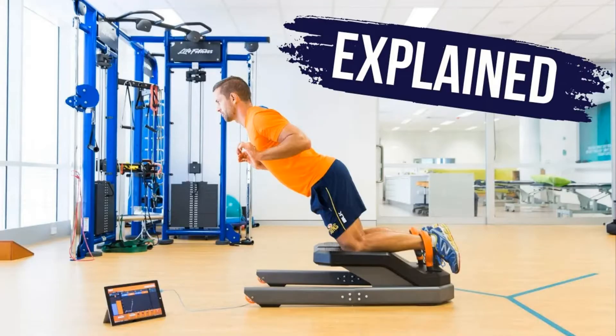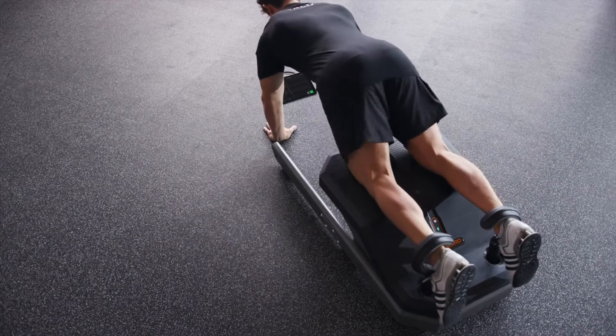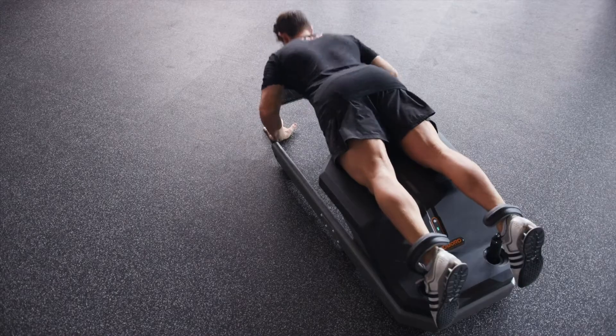I'm going to start off by briefly talking about the Nordic hamstring exercise test. If you want more information on this, I have another video that covers the Nordic hamstring exercise strength test on a Nordboard in much greater detail. As a brief overview, this is a test of eccentric hamstring strength during a knee-dominant position whereby an individual carries out a Nordic hamstring curl — sometimes referred to as a Russian lean — whereby from a kneeling position, the hips do not change position and the individual leans forward, extending at the knees.